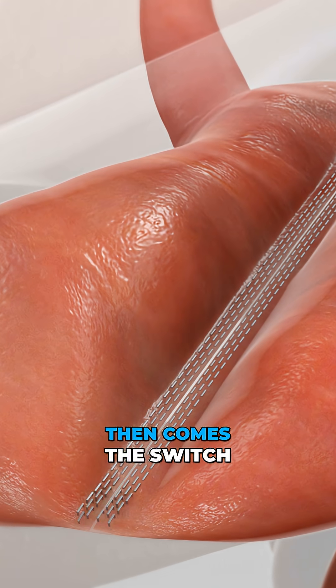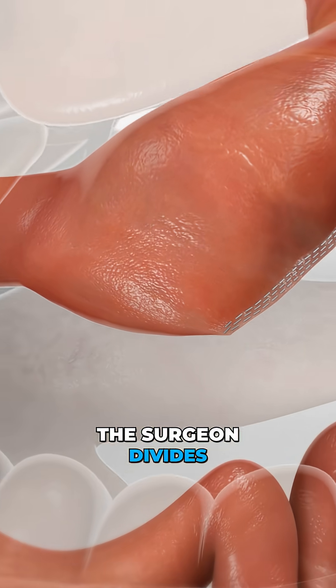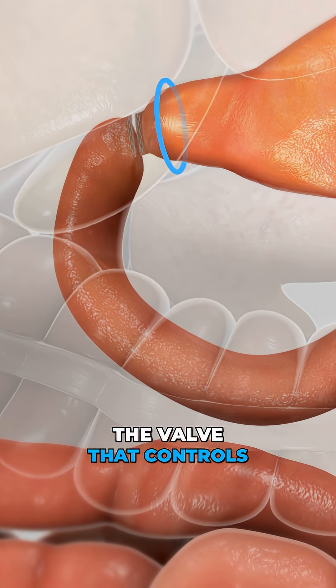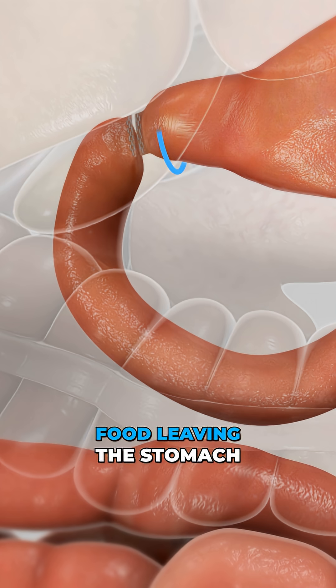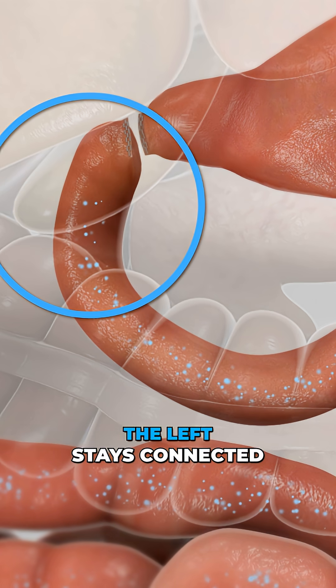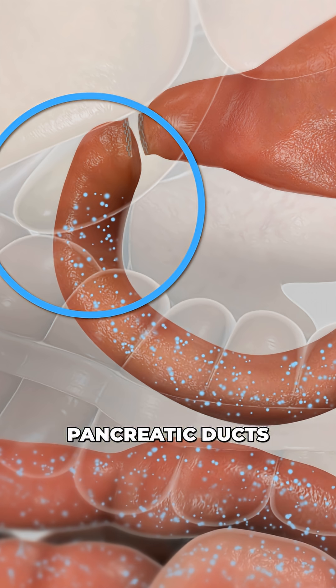Then comes the switch. Using staples, the surgeon divides the small intestine right below the pyloric sphincter — the valve that controls food leaving the stomach — creating two limbs. The limb on the left stays connected to the bile and pancreatic ducts.